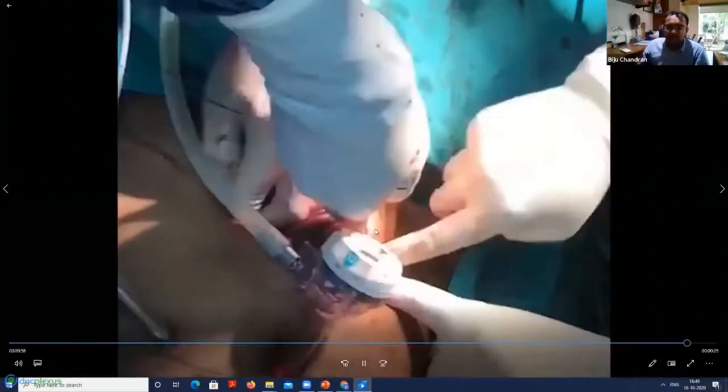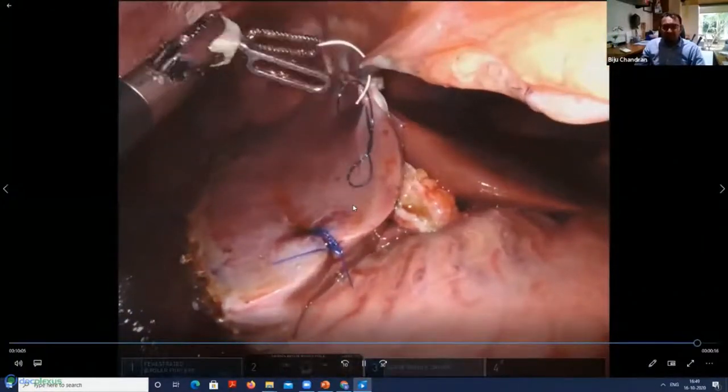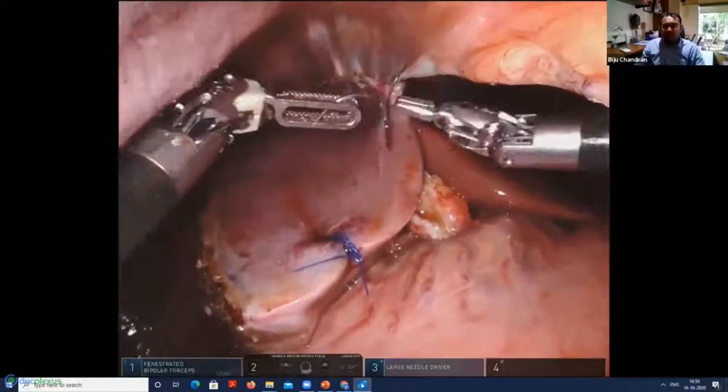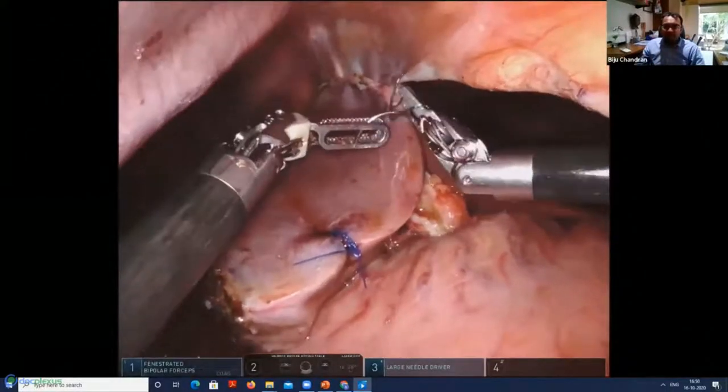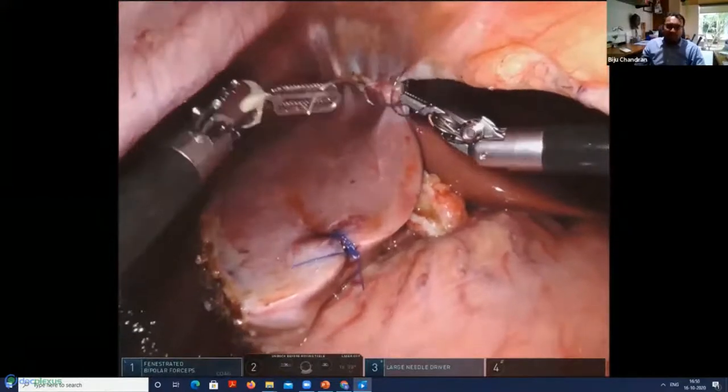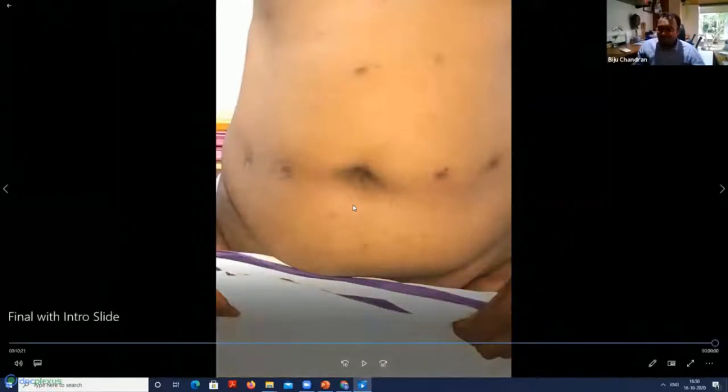The liver pops out through a Pfannenstiel incision without division of any rectus muscle. The liver is delivered and the falciform ligament is fixed back. We ensure perfect hemostasis, raise the drain, and confirm there is no leak. This is what we ultimately give back to the patient — a lot of effort goes into this procedure.